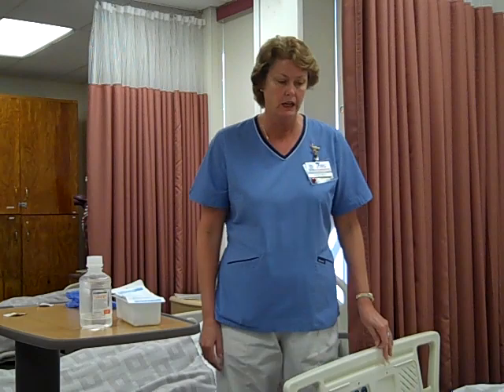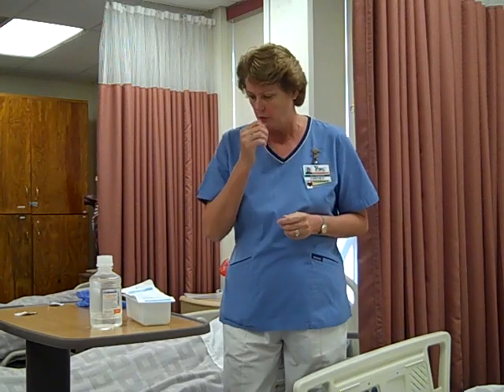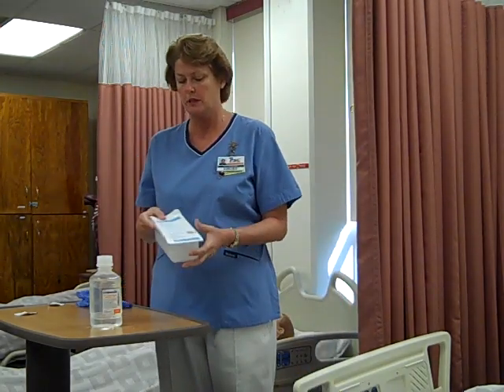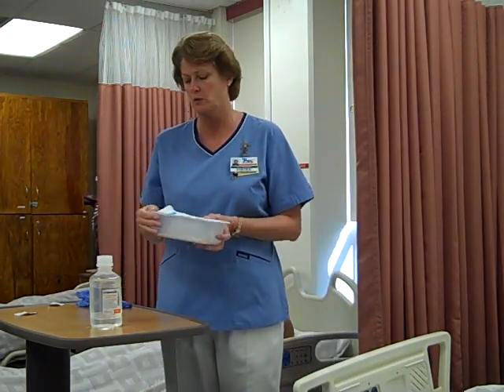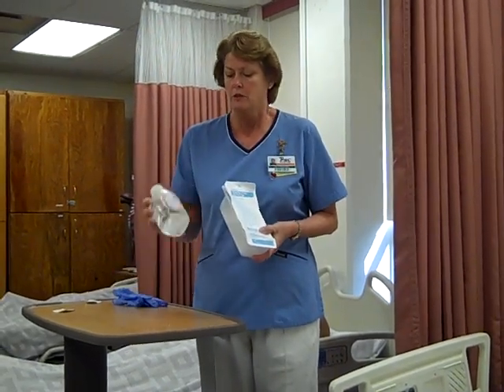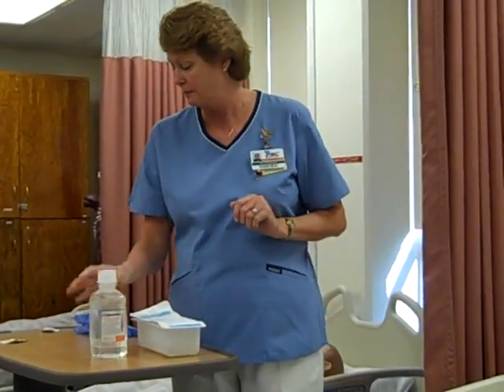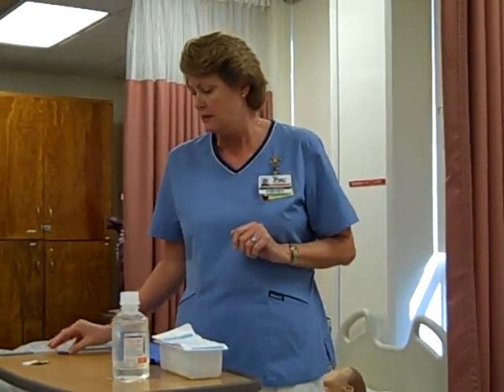I'm going to be performing the skill of open bladder irrigation. We've checked our doctor's order, and for whatever reason, we need to irrigate the patient's catheter. We'll get our equipment, which is going to be an irrigation syringe and tray — normally you're going to use a piston syringe, and that's what this is. Also, a sterile bottle of normal saline; we're going to check and make sure the expiration date's good. We'll also need gloves and probably an extra alcohol swab.